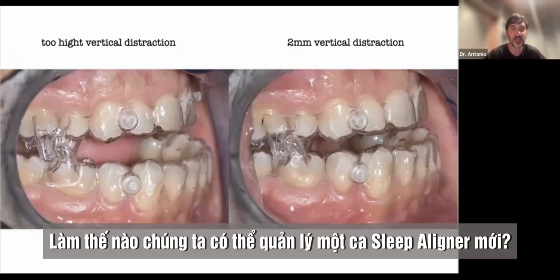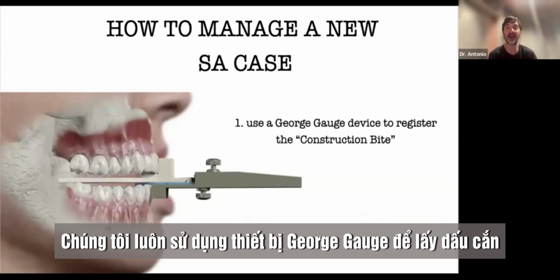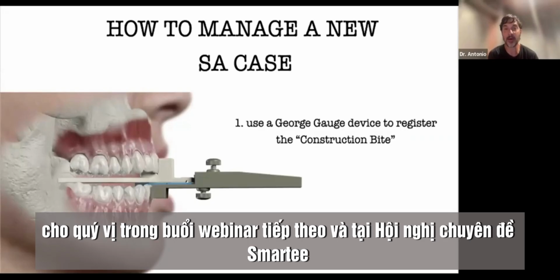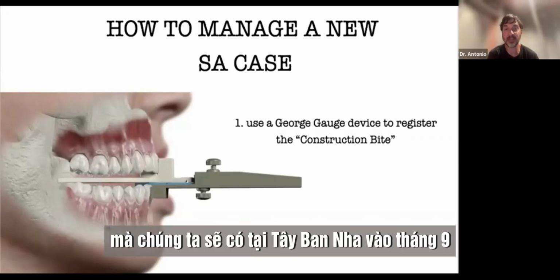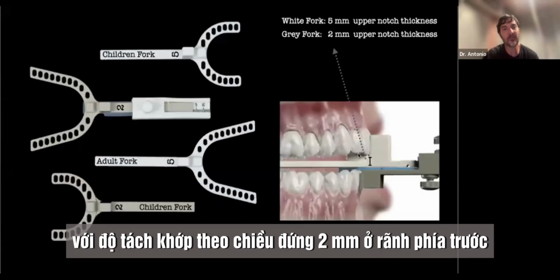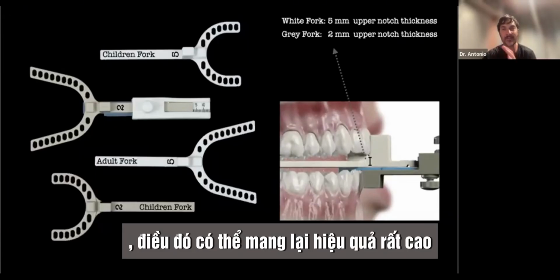How can we manage a new sleep aligner case? We always use a George gauge device to register the construction bite. Dr. Milano will explain it in depth in the next webinar and in the Smartee symposium that we will have in Spain in September. But anyway, what we suggest is to use the adult fork with 2 millimeter of vertical distraction in the anterior notch. That gives you the opportunity of having as little vertical distraction as you can. That can be quite effective.